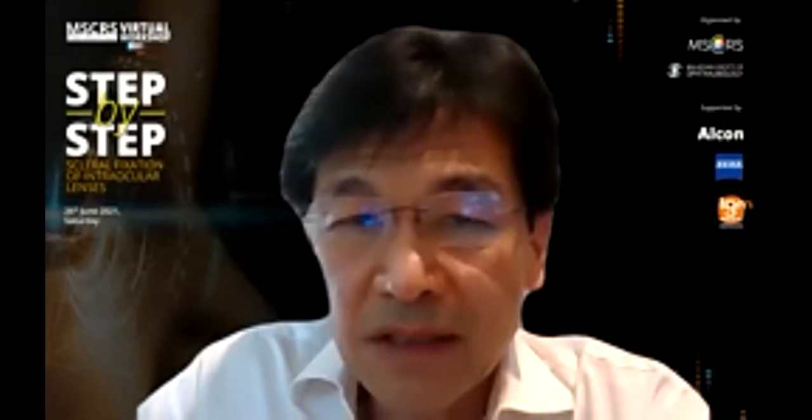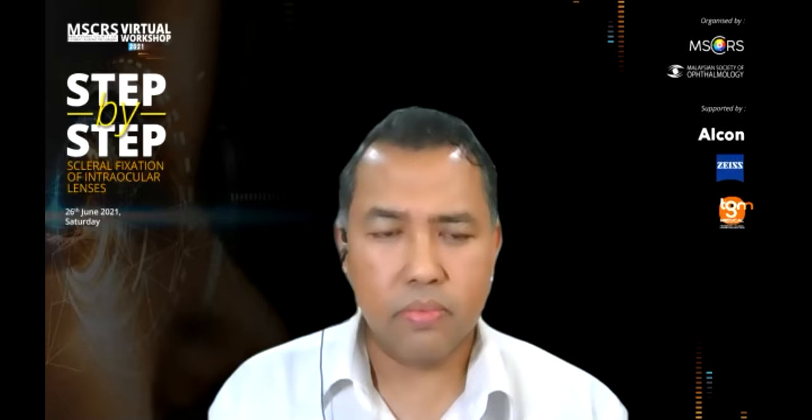Dr. Dennis, would you entertain using 9-0 instead of 10-0? I think 9-0 would be better than 10-0. The bigger, the better, I think. Actually, I'm using 9-0. I think 7-0 is too difficult to manipulate. I use 9-0, and 9-0 is okay. It's available in the market.